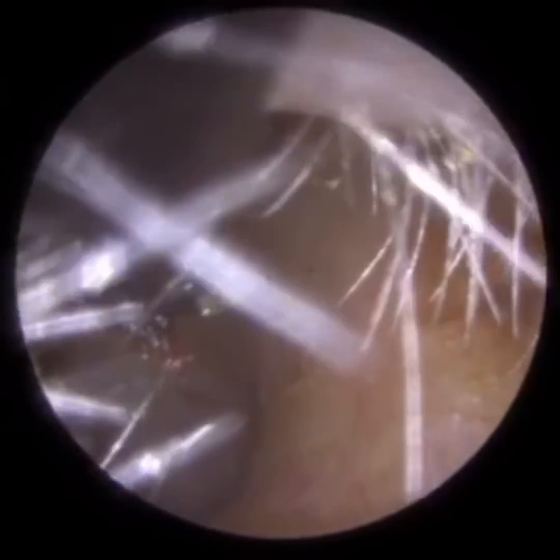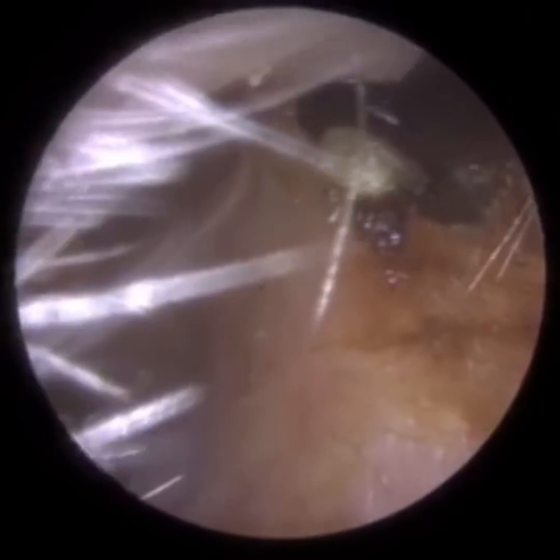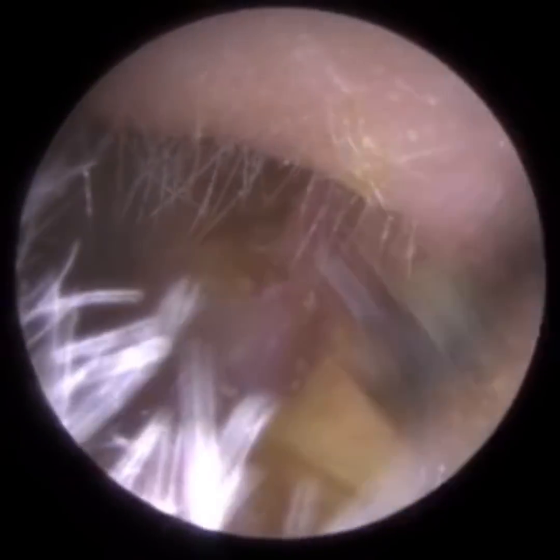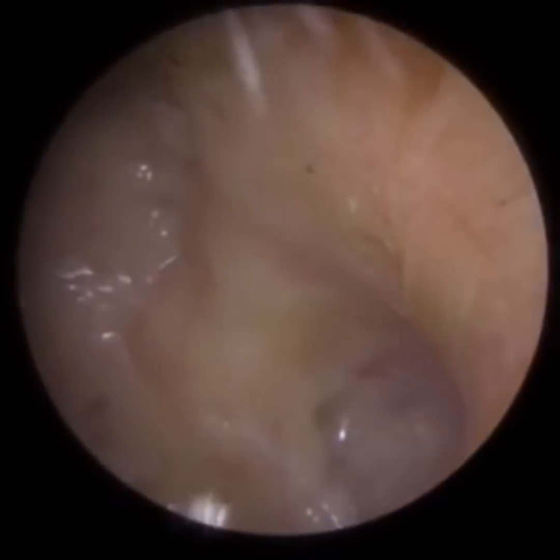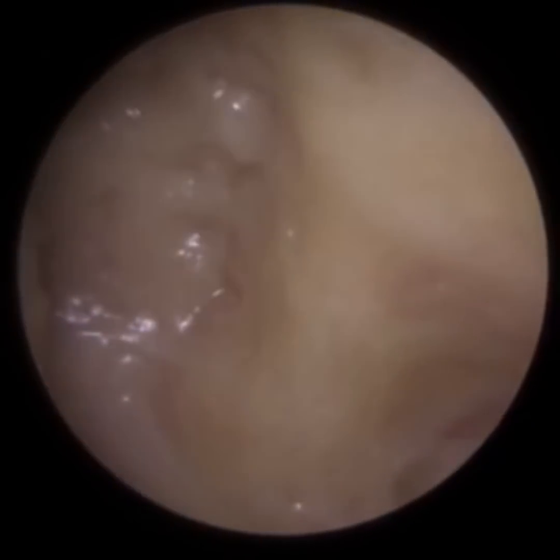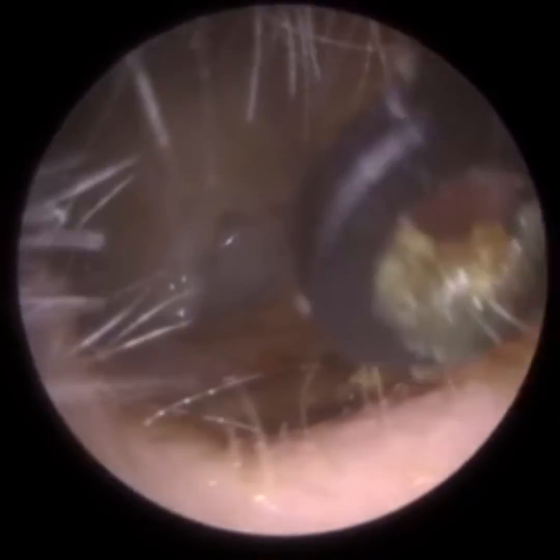It can lead to a brain abscess, meningitis. So what the surgeon did — they had to get access into the middle ear, as this cholesteatoma had grown into the mastoid bone around the back of the eardrum. They had to chisel out the bone of the ear canal. You can see top right there — that's the patient's attic region. They had to literally scrape out the bone, remove all that cholesteatoma and dead skin, and then reposition the eardrum.